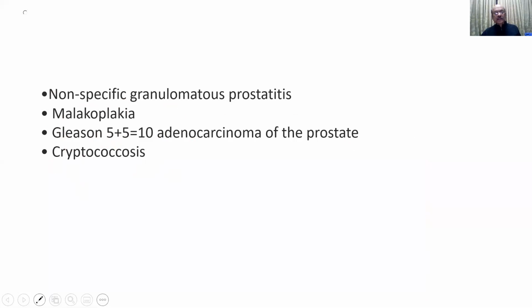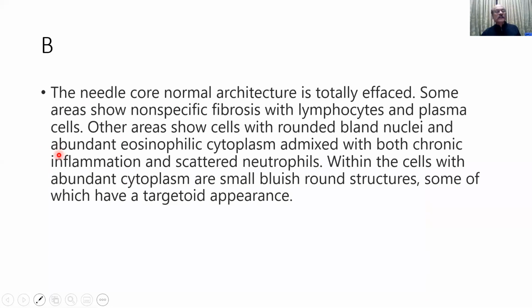Here the diagnosis is malakoplakia, because those are actually Michaelis-Gutmann bodies. They have a targetoid appearance.